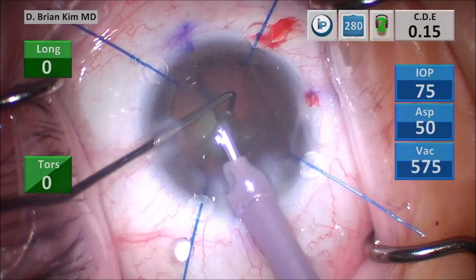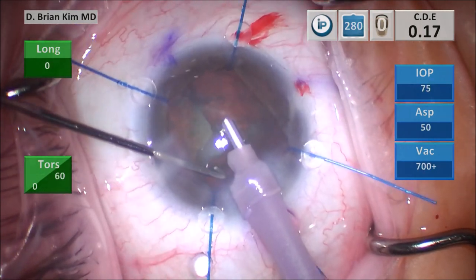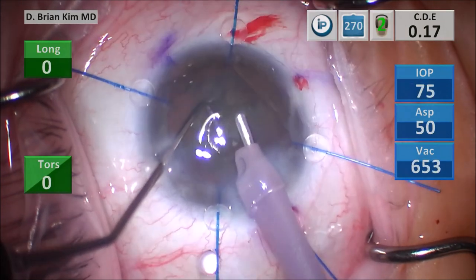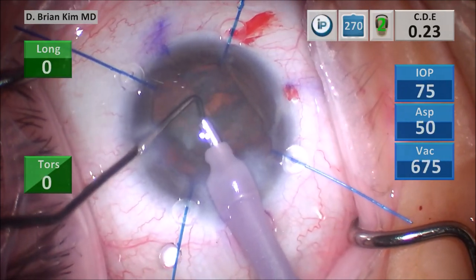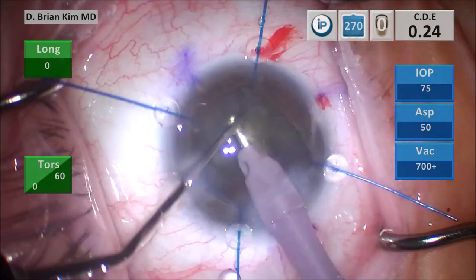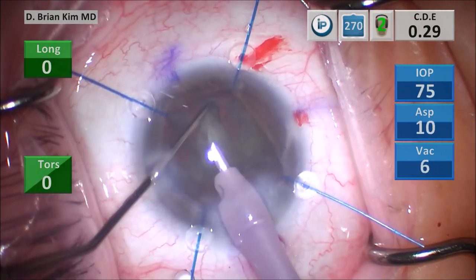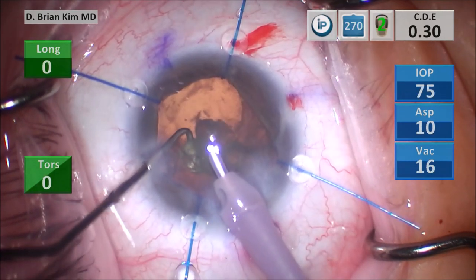I'm using successive mechanical fracturing forces: placing the chopper out to the equator, bringing the faco tip deep, crushing the lens piece, bisecting the lens pieces, then grabbing them with a little vacuum, crushing with the chopper, and using high vacuum to aspirate them out. This is the last quadrant — place the chopper out to the equator, pull it centrally towards the faco tip, crush that quadrant in half, and aspirate the pieces as they become smaller. I'm carefully prolapsing the lens pieces out of the bag with the chopper rather than chasing them with high vacuum, because I can inadvertently grab the bag, especially if the bag is weak with weak zonules.